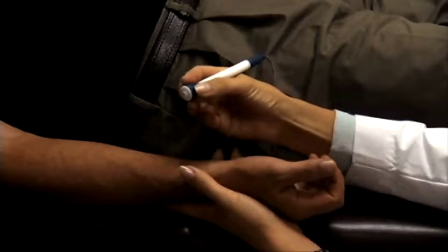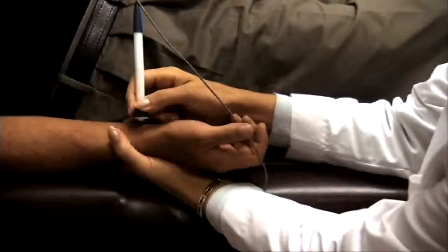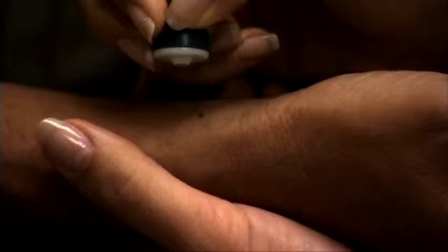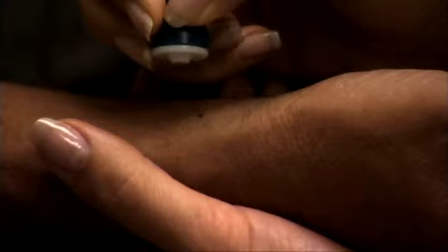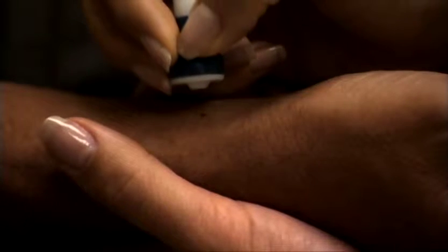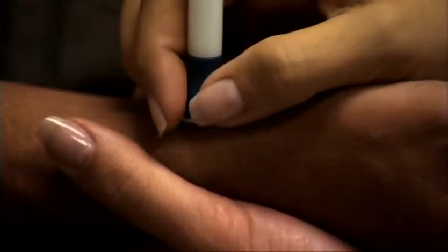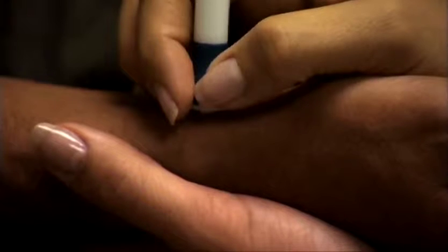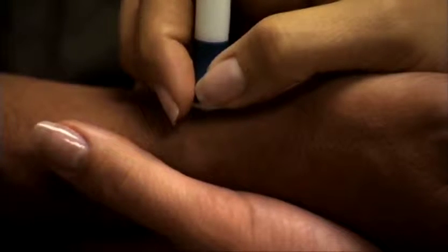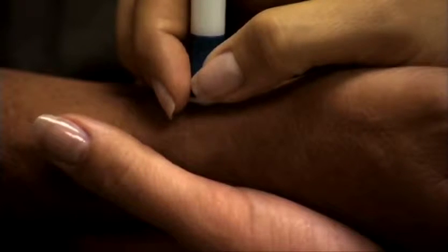Hold the tonometer firmly at the sides of the base, not the shaft, keeping the shaft perpendicular to the skin surface. Hold the tonometer over the strongest pulse point and visualize the dark gray sensing element at the center of the tip. Gently lower the tonometer so that the sensing element touches the strongest pulse point. Allow the tips of your fingers to rest on the patient's skin. Make sure your elbow, forearm, and hand are stable so the subject's hand is held without movement.